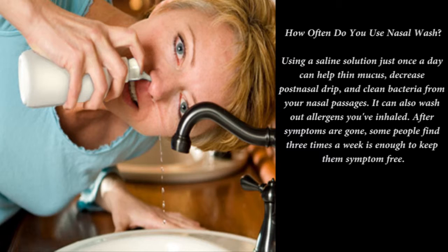How often do you use nasal wash? Using a saline solution just once a day can help thin mucus, decrease postnasal drip, and clean bacteria from your nasal passages. It can also wash out allergens you've inhaled. After symptoms are gone, some people find 3 times a week is enough to keep them symptom-free.